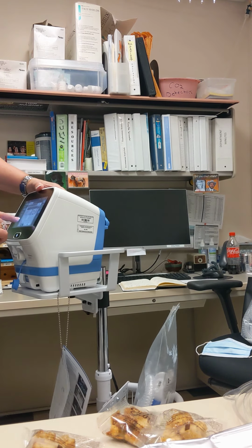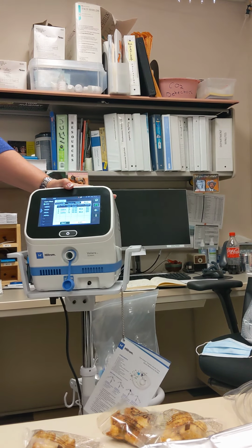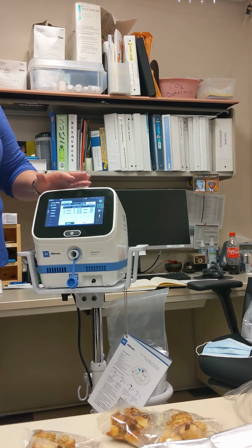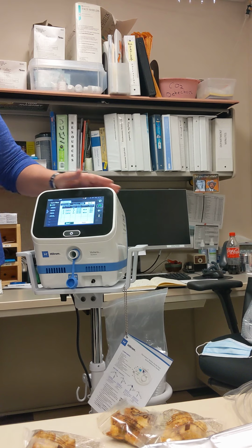Right, well, maybe because we first wanted to have a starting point and have it in automatic, but we couldn't get in there to do anything. And also, that nebulizer is loud. Yeah, you can turn off the neb. Yeah, now we can. Okay.